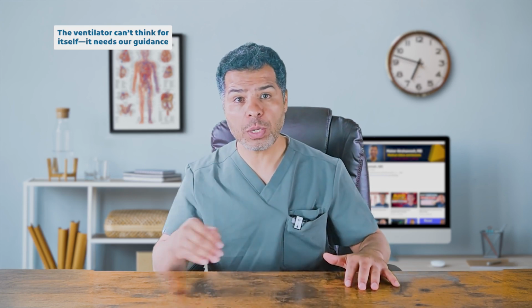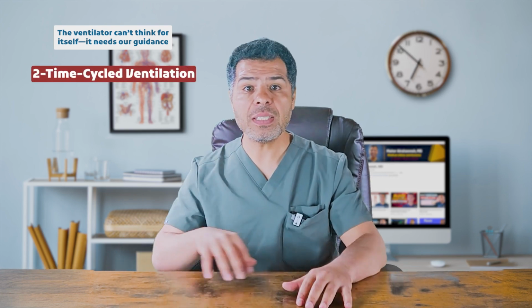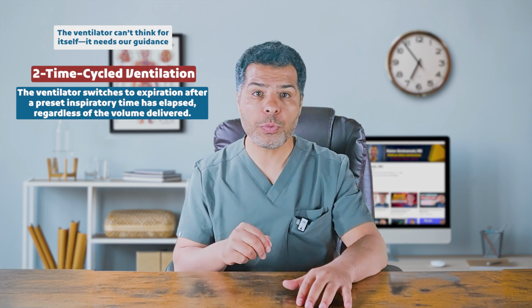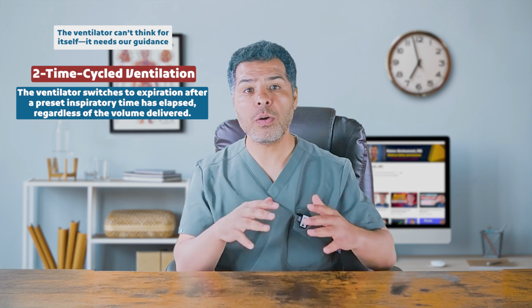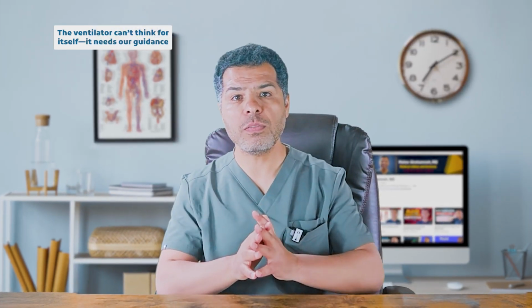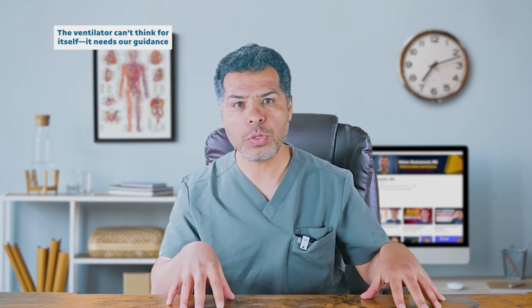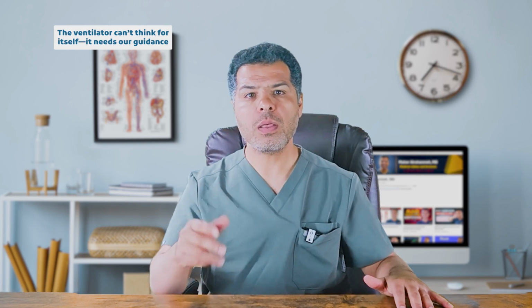Now, the next way the ventilator terminates a breath and cycles from inspiration to expiration is time cycle ventilation. In time cycle breath, the ventilator switches to expiration after a preset inspiratory time has elapsed, regardless of the volume delivered. Check this ventilator screen for the set inspiratory time and see that the green line in all the curves switches to yellow after the set inspiratory time elapsed. Now, what do you think the tidal volume will be if we shorten the inspiratory time? It will be, of course, smaller, as we're spending less time delivering the breath, and the opposite is true.